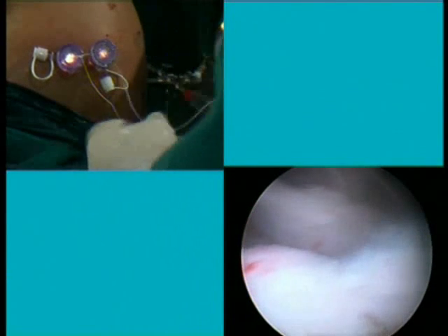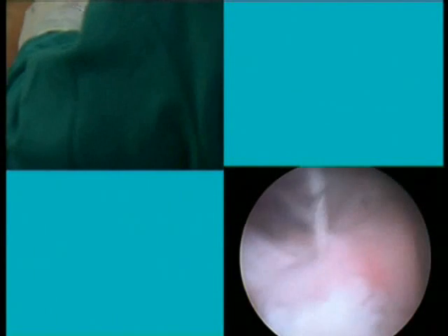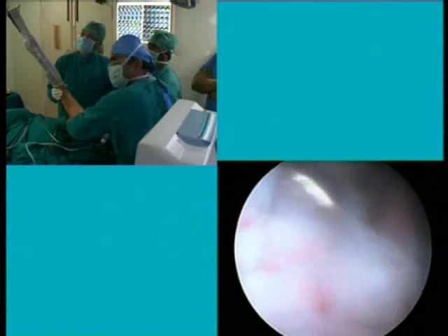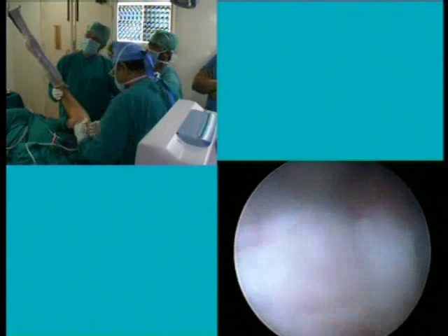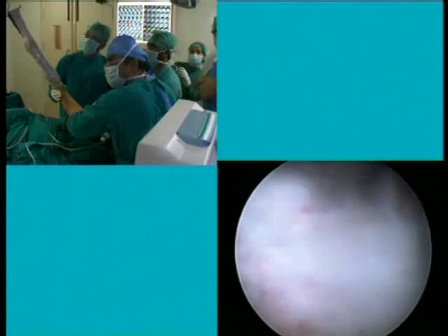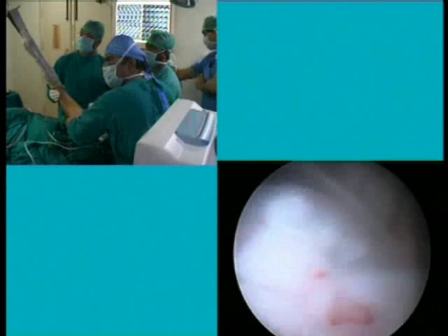Now I'm sliding, and now I'm happy with that. If you just pull the camera here, okay, and I have just locked it. Now I will throw 3 to 4 alternating half hitches just to secure it further.